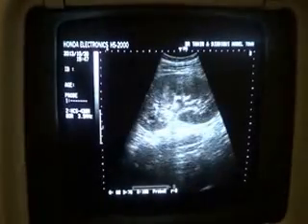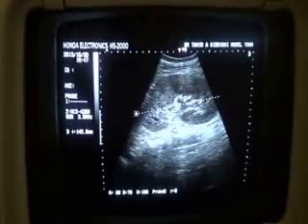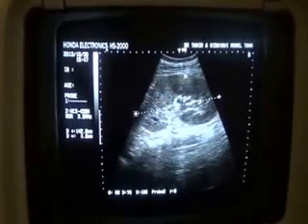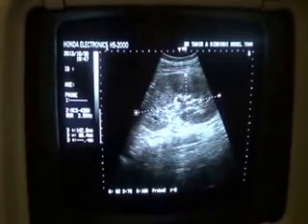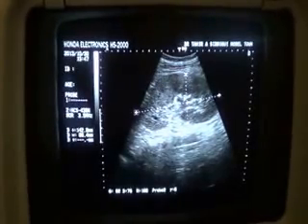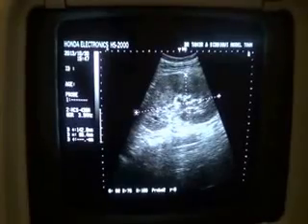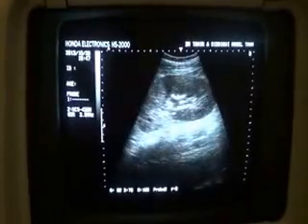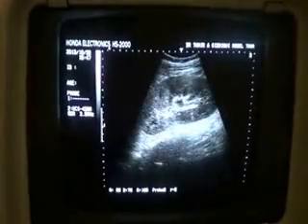Both kidneys are involved, this one being more involved than the other. This kidney measures 14.2 cm in length — more than 11 cm is considered enlarged. It measures 6.6 cm in anterior-posterior diameter — more than 5 cm is considered an enlarged kidney. This AP diameter is the most important, as length varies with geographic area and height; for a tall person, normal length may be up to 12 cm.